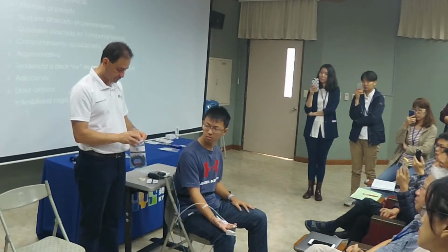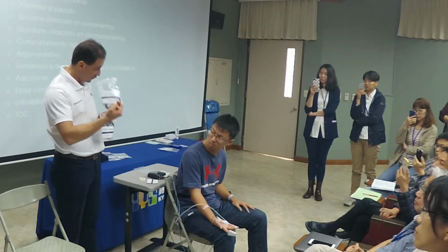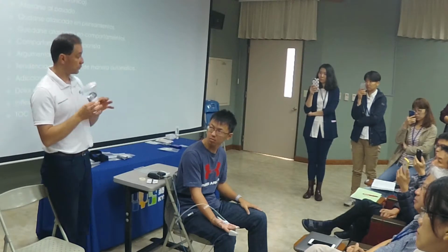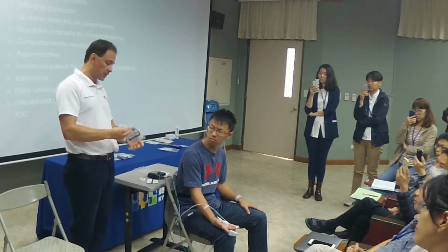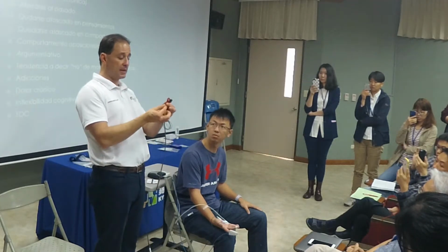And the way you do it, you can use either. You have EEG and EXG. The system comes with two of these. This can be used for both EMG and neurofeedback. So what I recommend people do when they buy the Nexus is that they put one away and just work with one, so in case this one gets ruined, you have the other. Now the thing you have to be mindful and careful about is these endings right here. You have to make sure you don't bend them from here too much, or from here too much, because that will shorten the sensor's life.